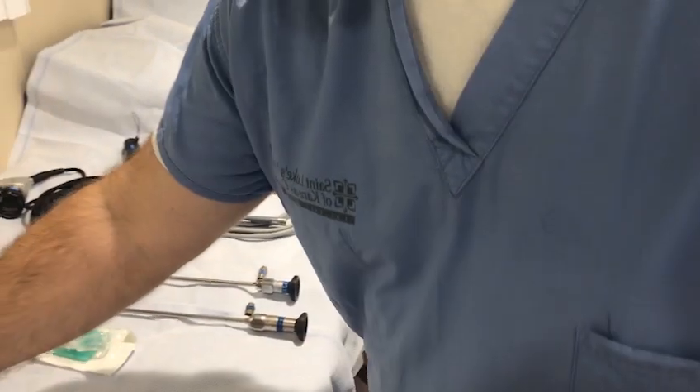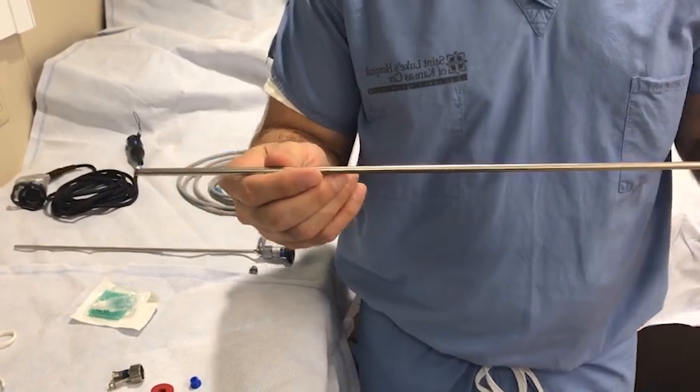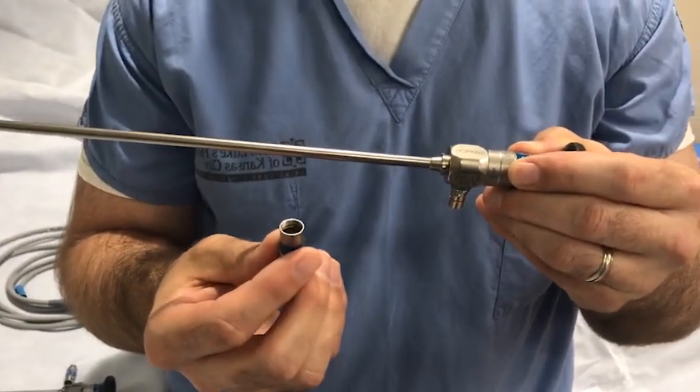Next you will need to assemble your telescope. Use the zero degree telescope for intubation and entry into the trachea. There are small connectors that attach to the telescope; ensure that these are attached.